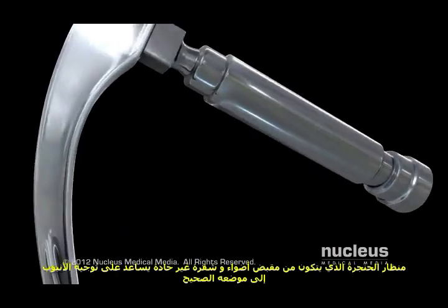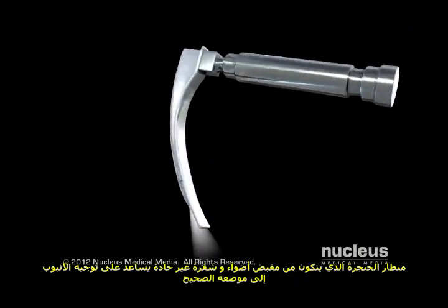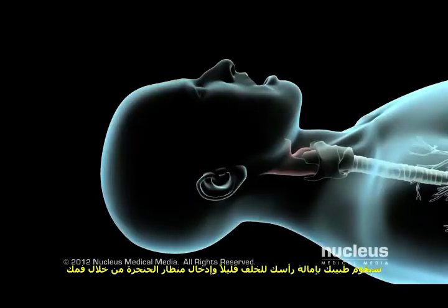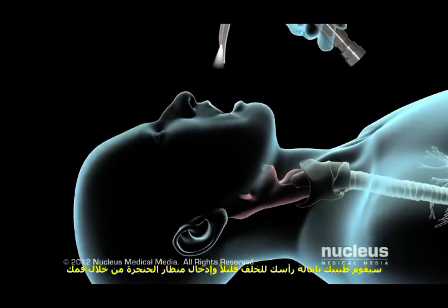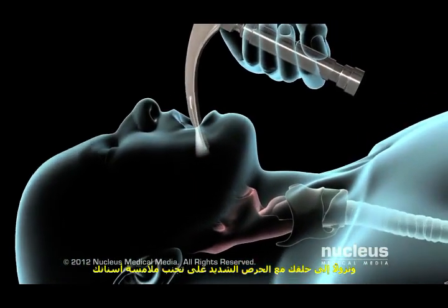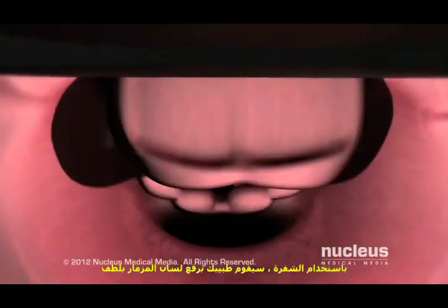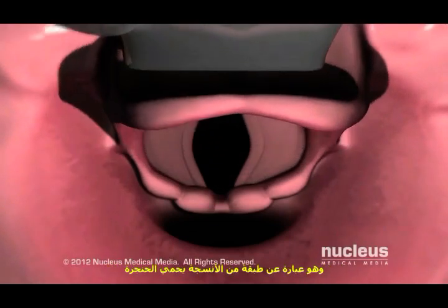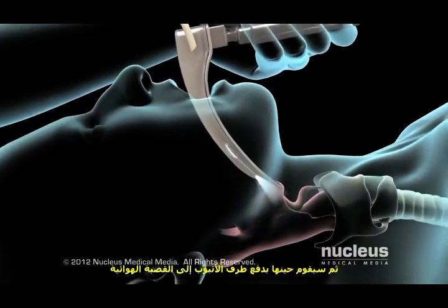A laryngoscope, which consists of a handle, light, and dull blade, helps guide the endotracheal tube to its proper position. Your doctor will tilt your head back slightly and insert the laryngoscope through your mouth and down into your throat, taking special care to avoid contact with your teeth. Using the blade, your doctor will gently raise the epiglottis, which is a flap of tissue protecting your larynx. He or she will then advance the tip of the endotracheal tube into the trachea.